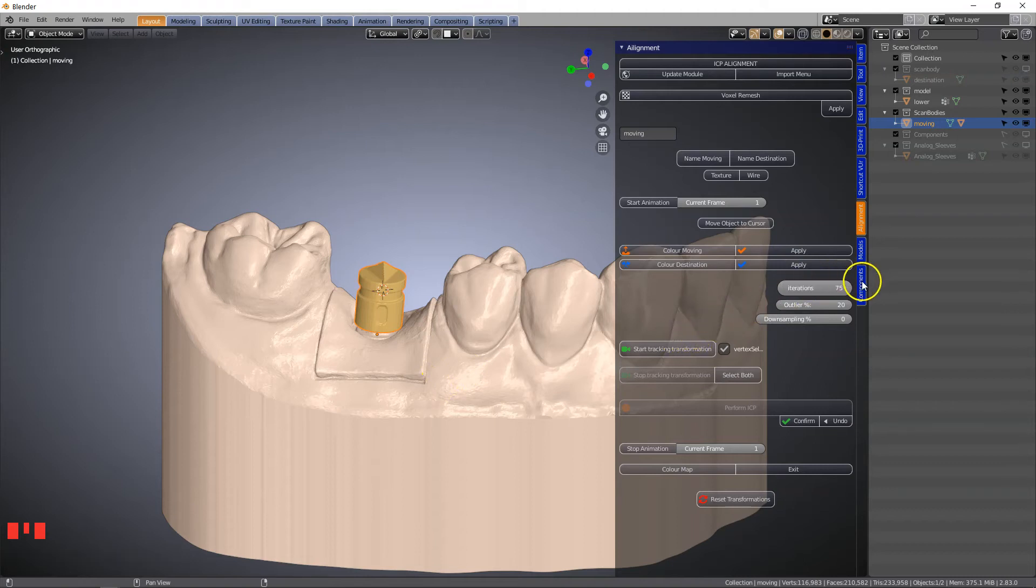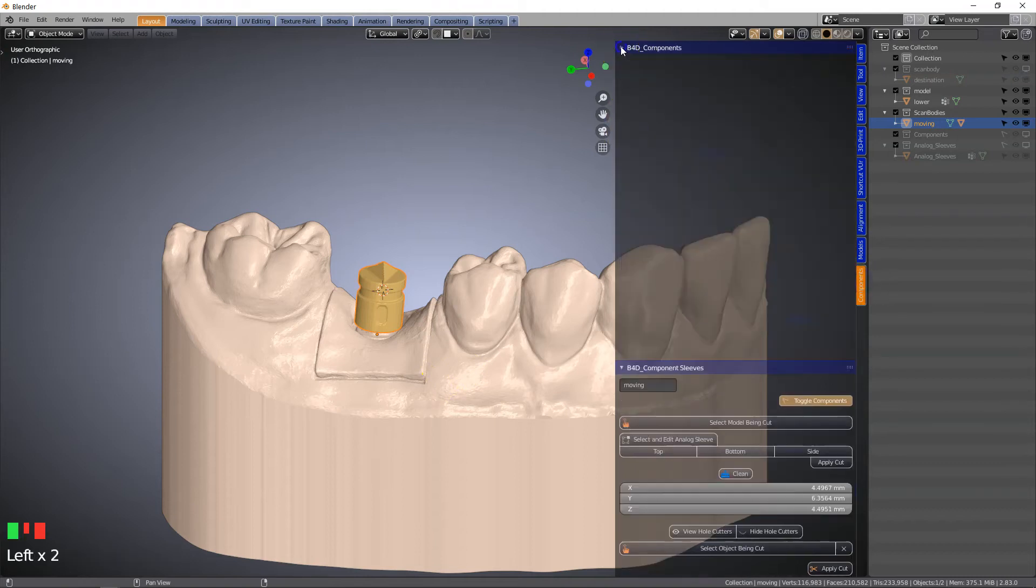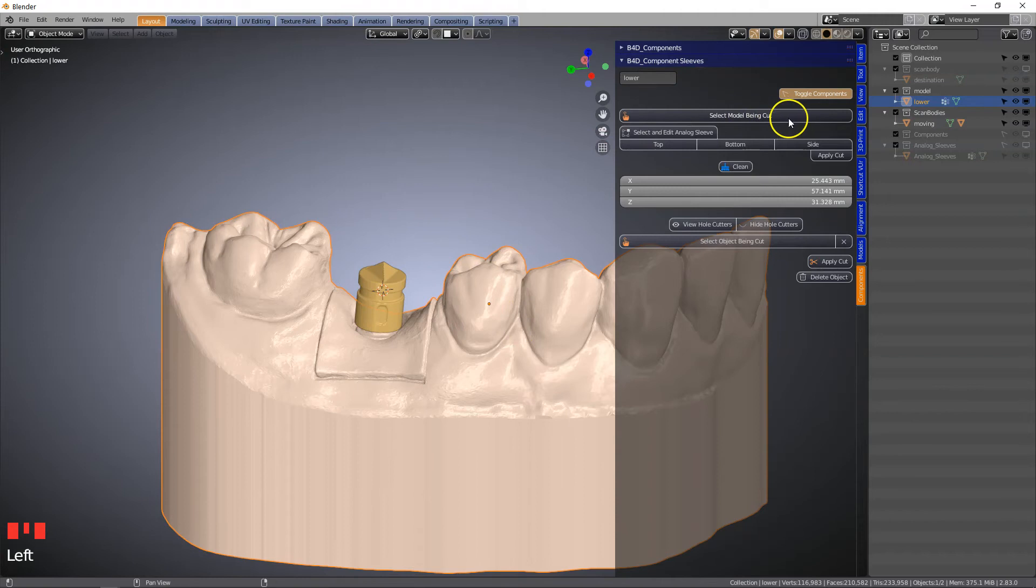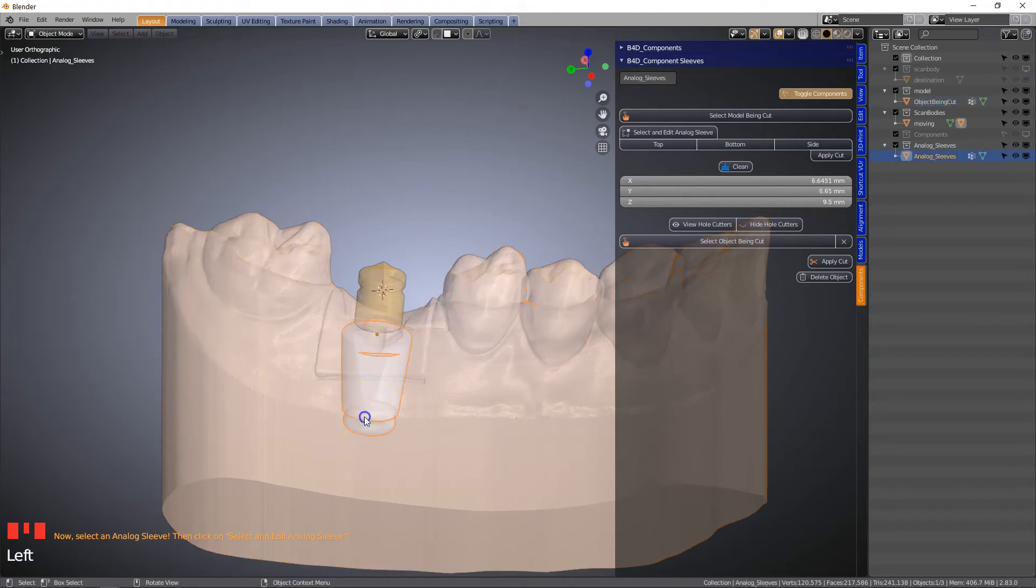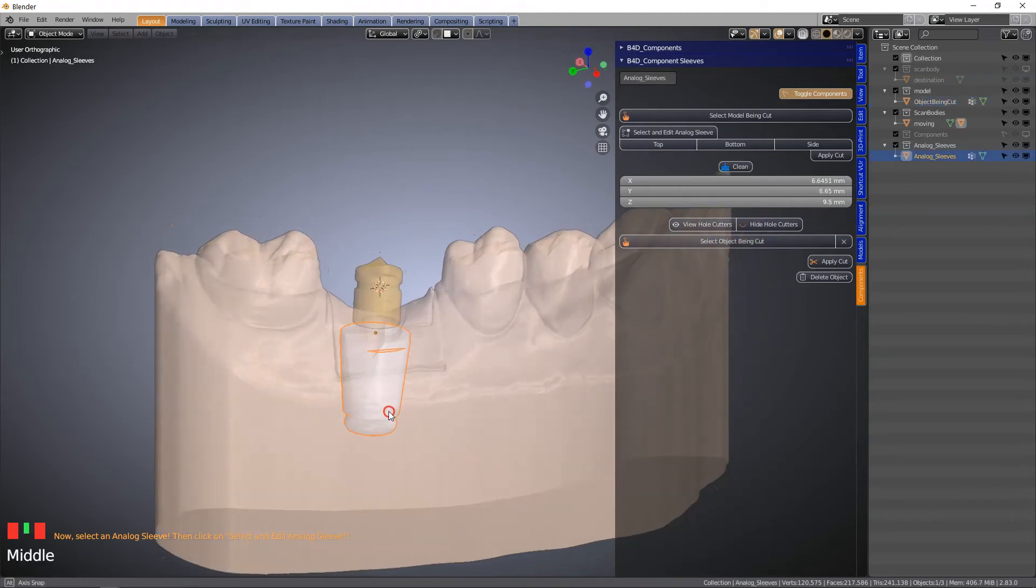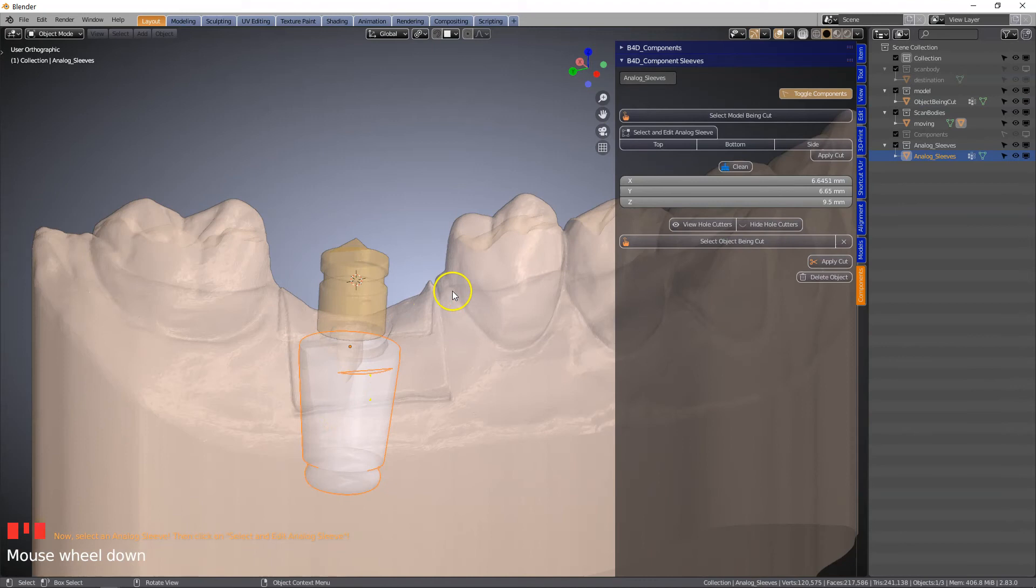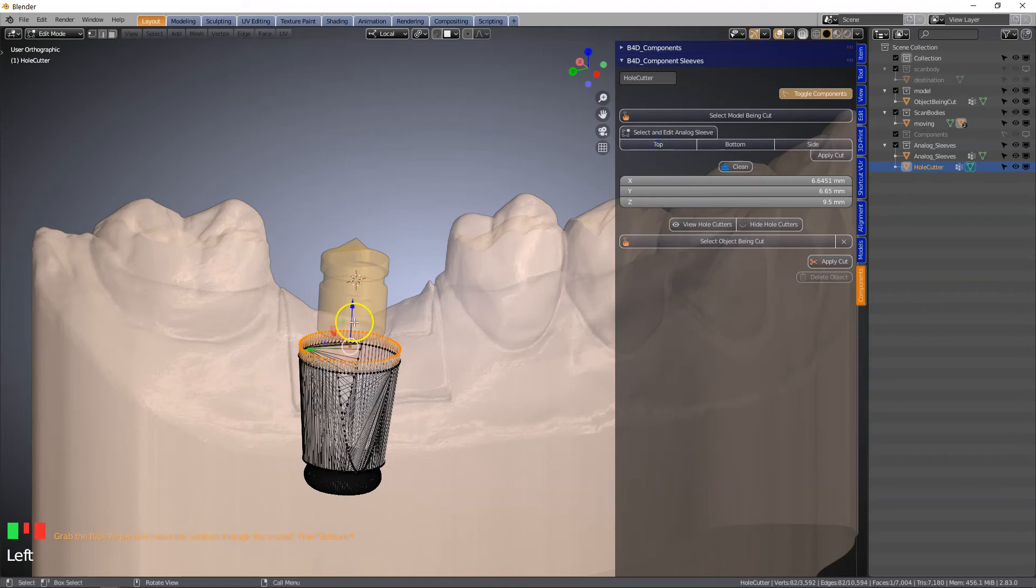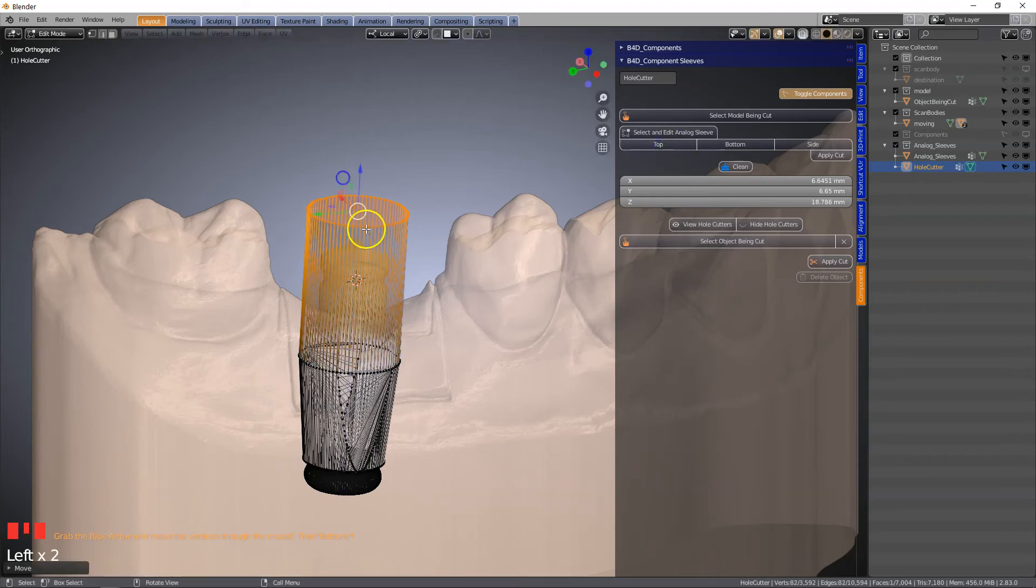The next thing I want to do is go to the component in the second menu. We're going to select the model, select model being cut. Then we're going to click on the analog because it is transparent. Select and edit analog. We're going to click on top. Use the blue arrow and move it through the model.